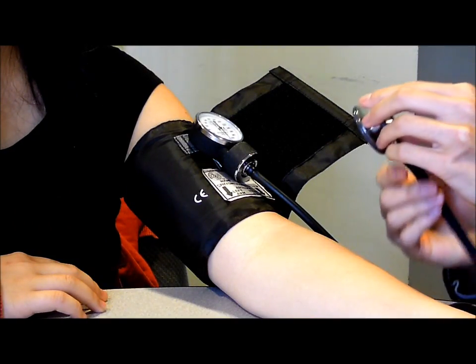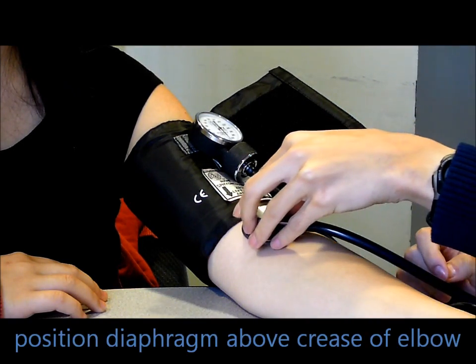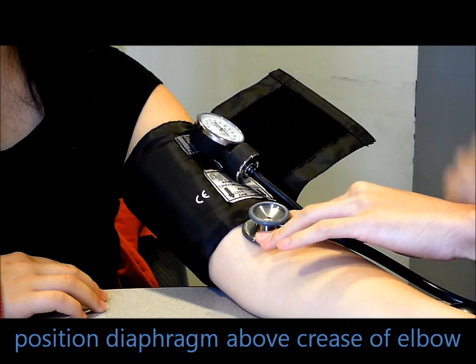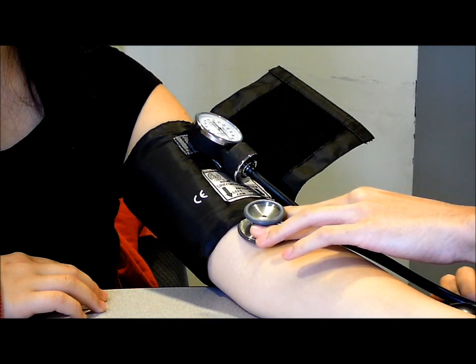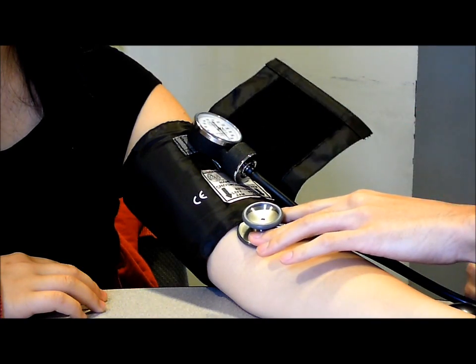First, position the diaphragm of the stethoscope against the skin just above the inner crease of the elbow, so that the surface of the diaphragm rests snugly against the surface of the skin, just below the lower edge of the blood pressure cuff. It's best to hold the diaphragm of your stethoscope with the middle and index fingers so that you don't confuse the radial pulse of your thumb with the pulse of the patient.